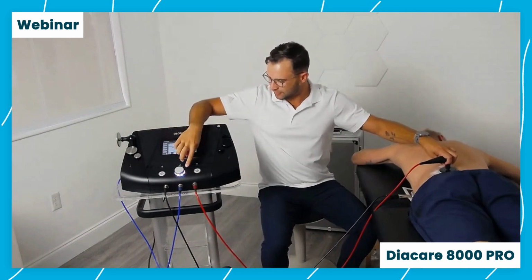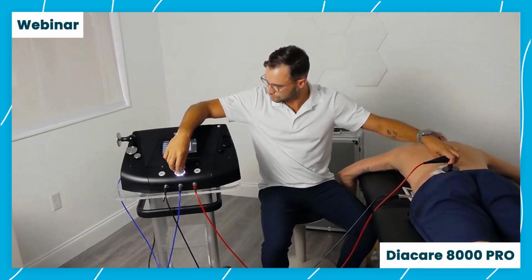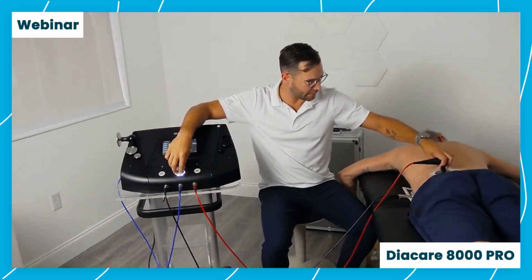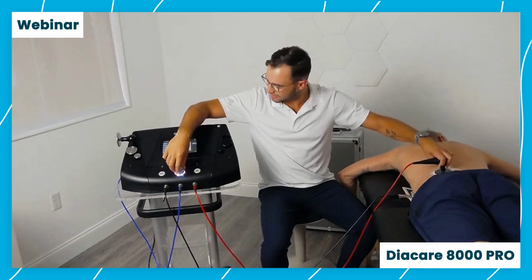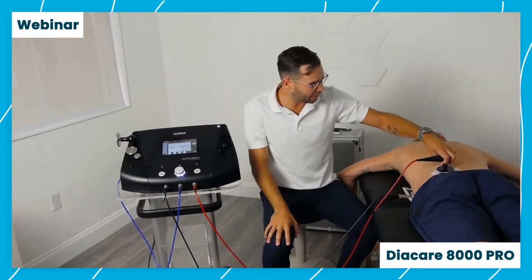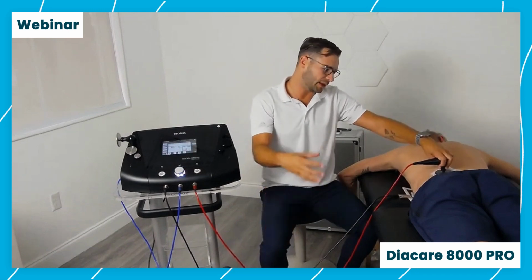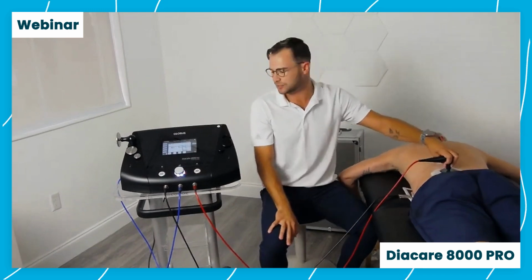So right away we can start by increasing the intensity. One of the great things about the Diacare is that it's giving us direct feedback immediately. So we can see how much energy is being put into the body, or is being generated at the tissue.